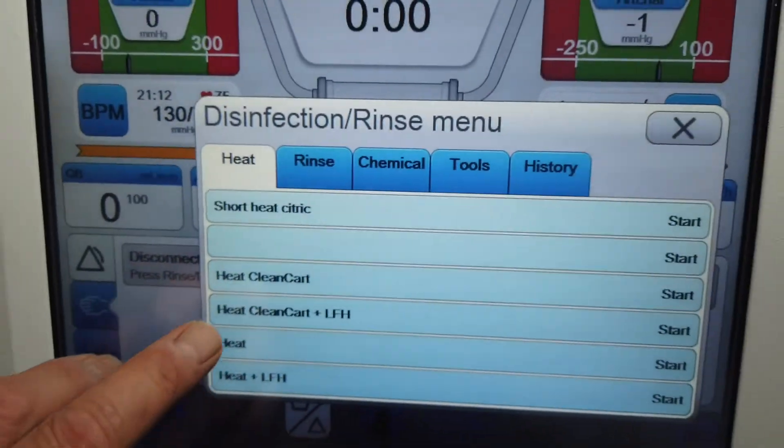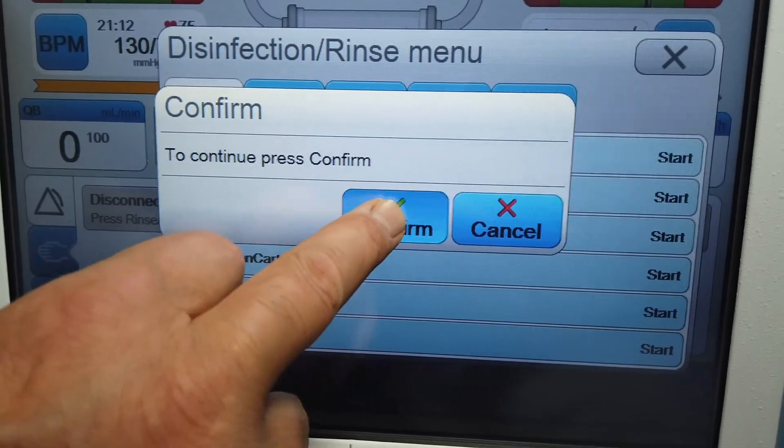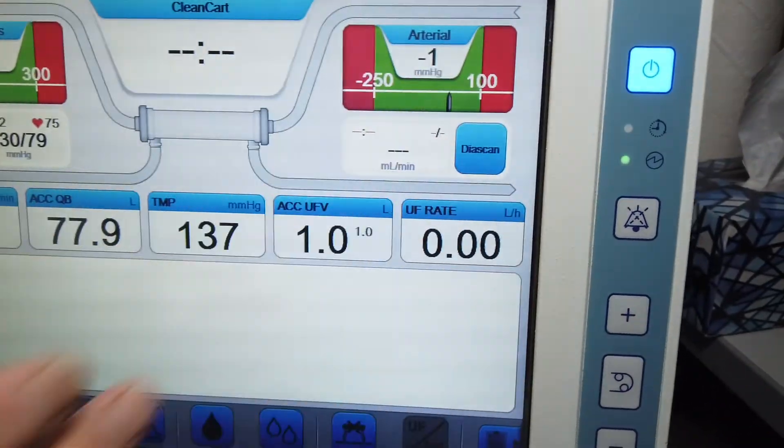Today, I'm going to do a heat clean cart. I press that. I go ahead and confirm it. Once it's confirmed, I can close off this menu.